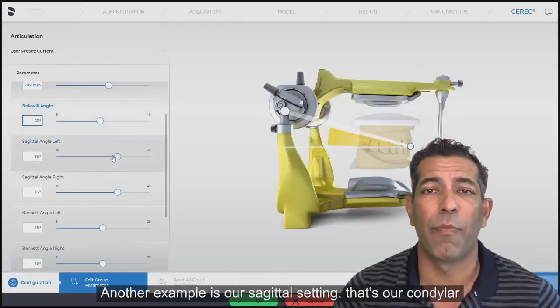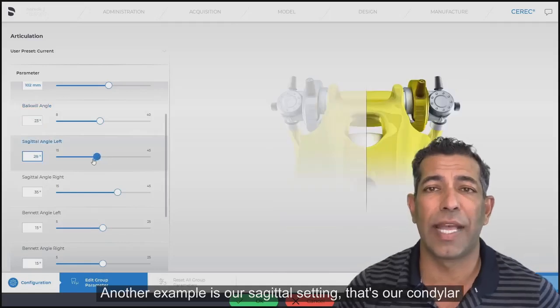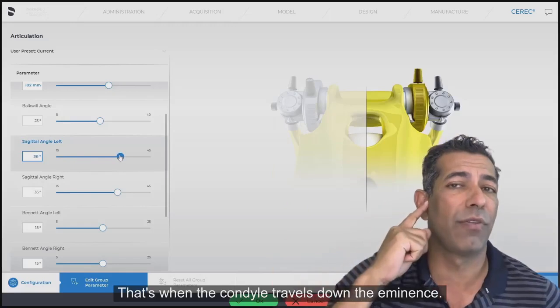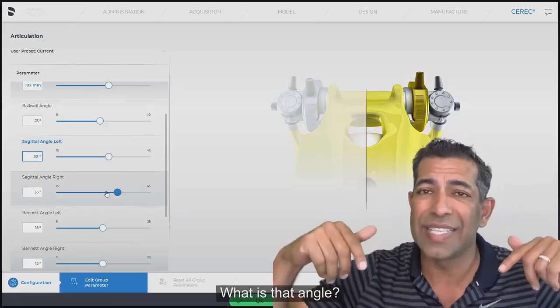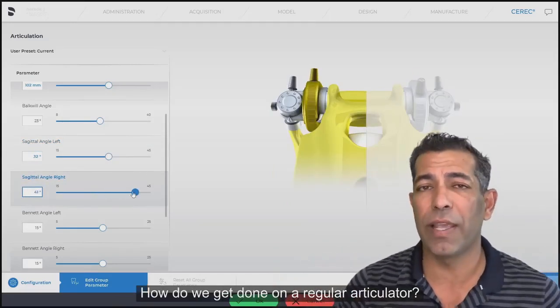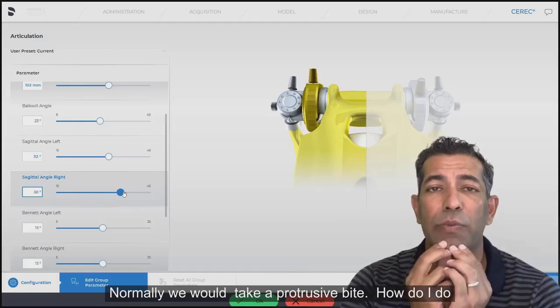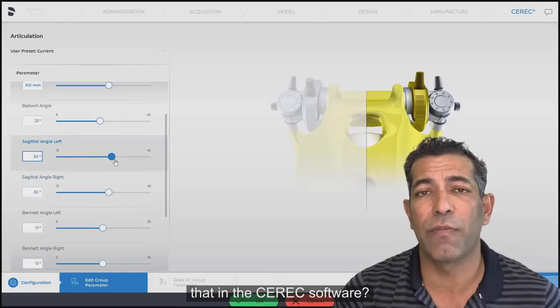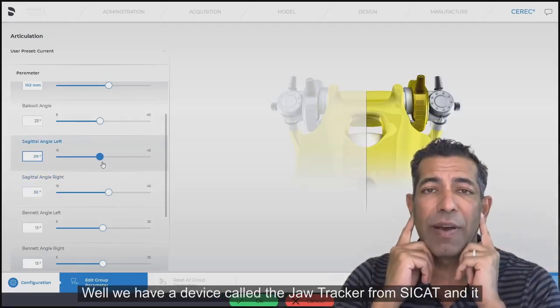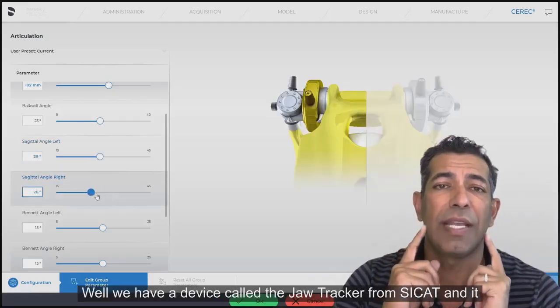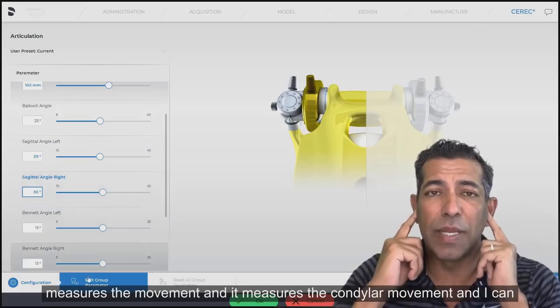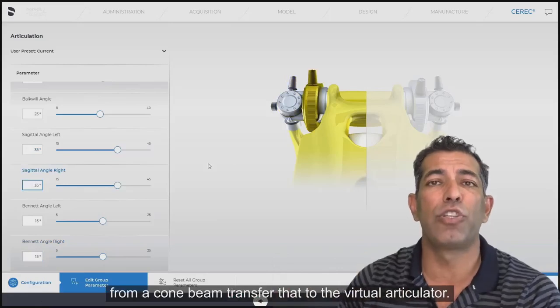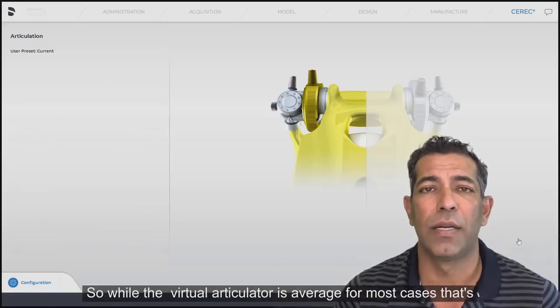That's just one example. Another example is our sagittal setting — that's our condylar inclination, when the condyle travels down the eminence. What is that angle? On a regular articulator, we normally take a protrusive bite. In the CEREC software, we have a device called the jaw tracker from SICAT, and it measures the condylar movements. And from a cone beam, I can transfer that to the virtual articulator.